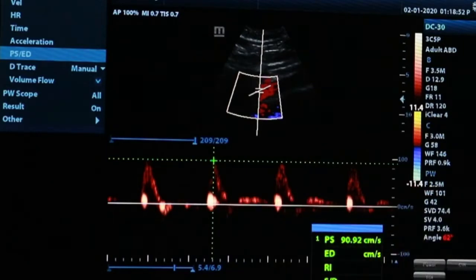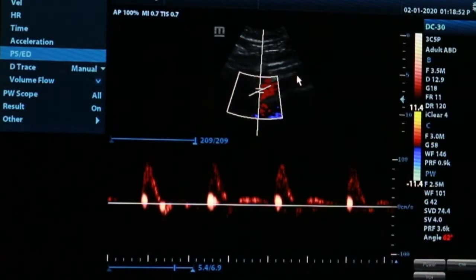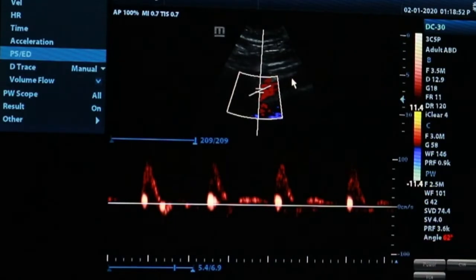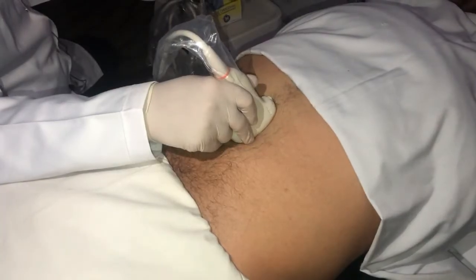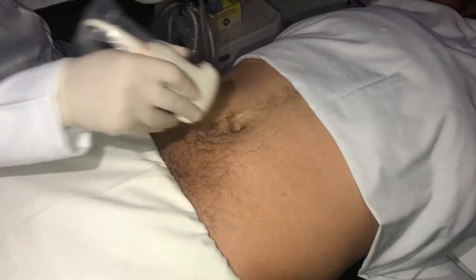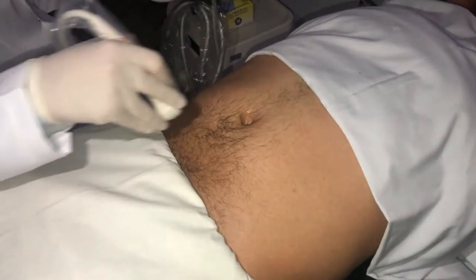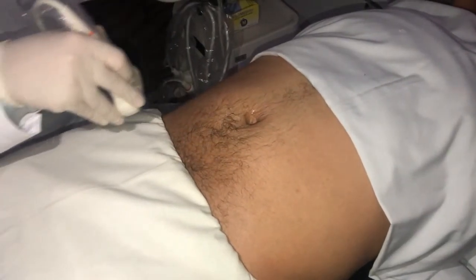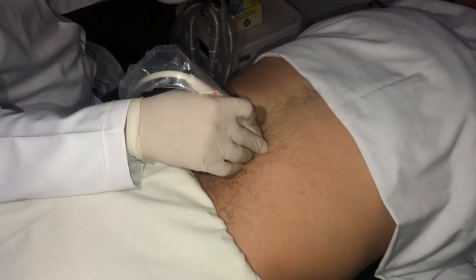The triphasic waveform like this indicates what? It indicates that the area we are measuring here is totally free, with no significant stenosis or occlusion. Also the area before and the area distal, at least 10 centimeter before and 10 centimeter distal. That means this aortic flow is considered normal, and then I will jump directly to check the common femoral here and common femoral here. If they are triphasic, that means the area between the aorta and the femoral is completely free of significant stenosis or occlusion.